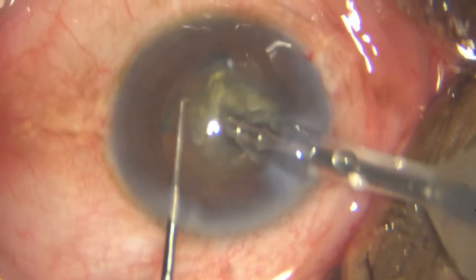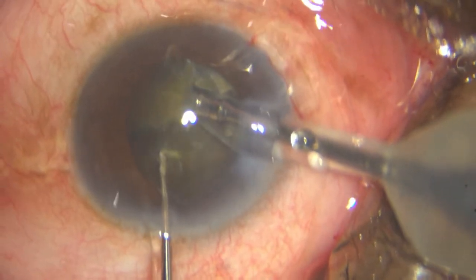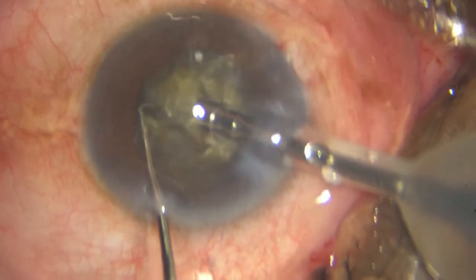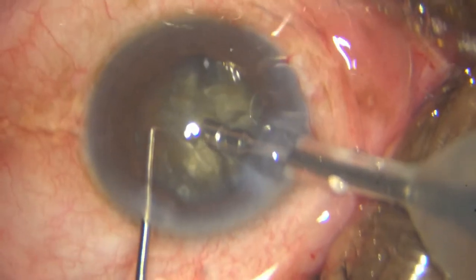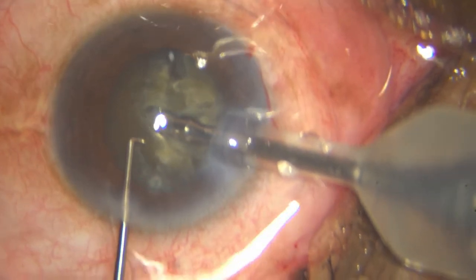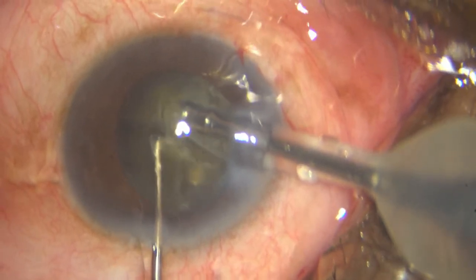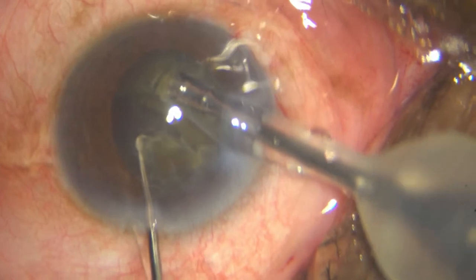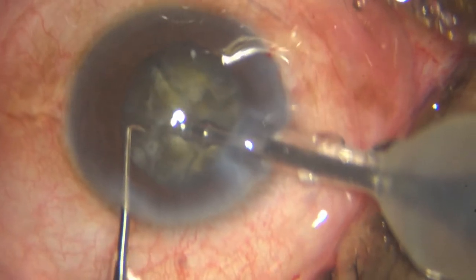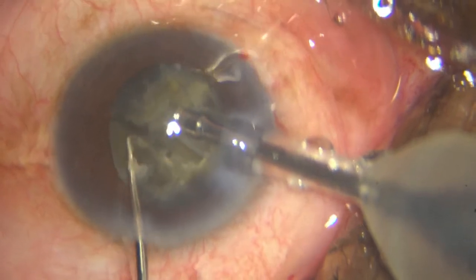Just make sure you propagate chops to the center, even if you have to do it at multiple passes. You can see that central disc forming there — that invariably tells you that you have a backbone.